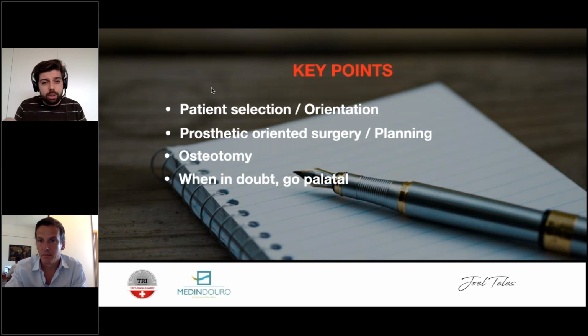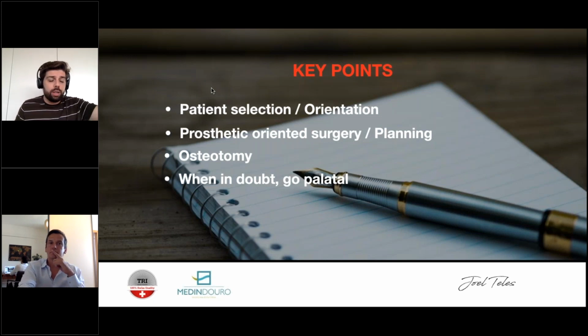If you have a 4mm ridge, don't approach it in the middle, because I would not use less than 3.7mm implants, and therefore you have only a very small amount of bone on the buccal side supporting your implants and all the forces from the inside out. Place it palatal. Assume 2 or 3 threads exposed and leave this big piece of buccal bone handling the forces. This is a mechanical treatment as well, so think biomechanically as well.